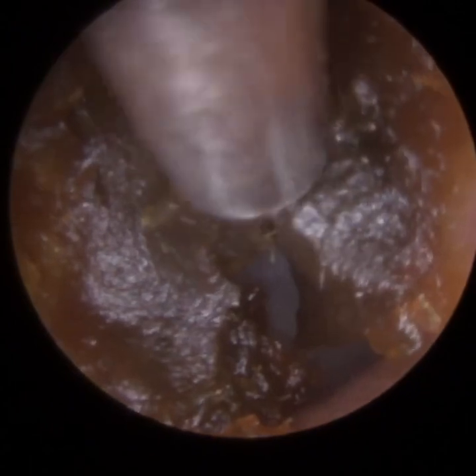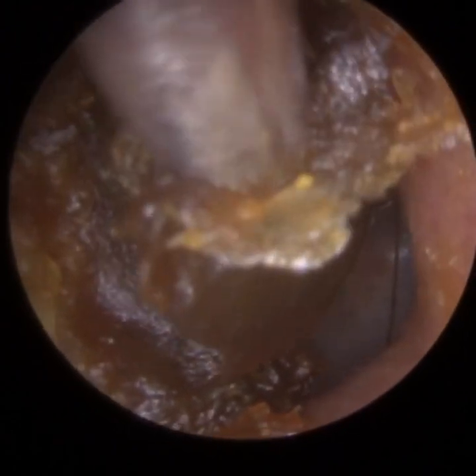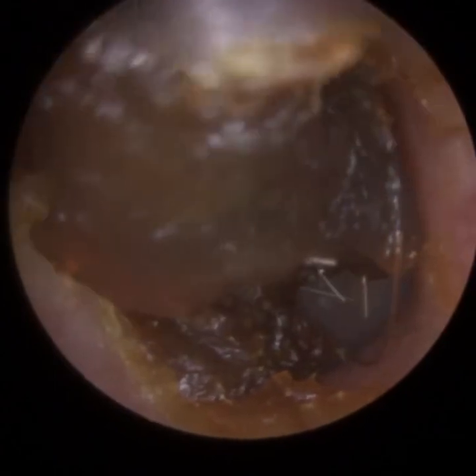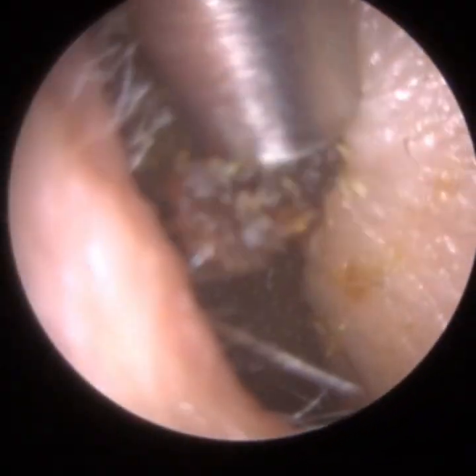It's a silicon dome, and if you carry on watching, at the end of this procedure you'll see some images of how it fits on the hearing aid, so it becomes a bit clearer. Because the dome had got lodged, the patient then put a new dome on the hearing aid and pushed that hearing aid into the ear, further lodging this dome, which caused wax that was coating the canal wall to be grazed off and then impacted against the eardrum.